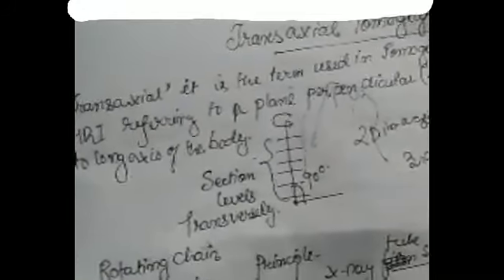Section tomography means slices, so this entire section will be from the transverse direction, as you can see mentioned in the image here. Basically, this will give you a 2D image, and from there we are going to create a 3D object. What you require in this case is an X-ray tube, the X-ray film or detector, and mostly a revolving chair.